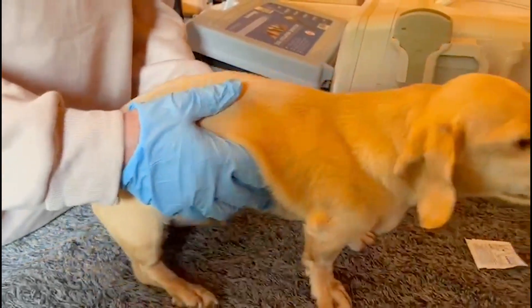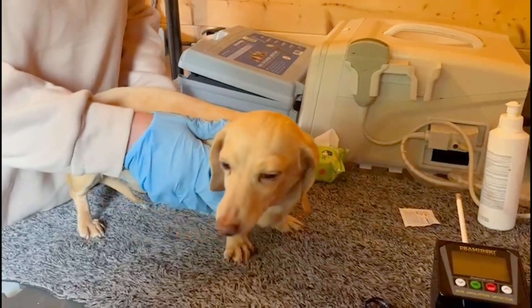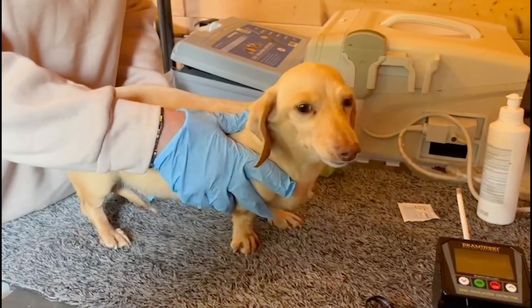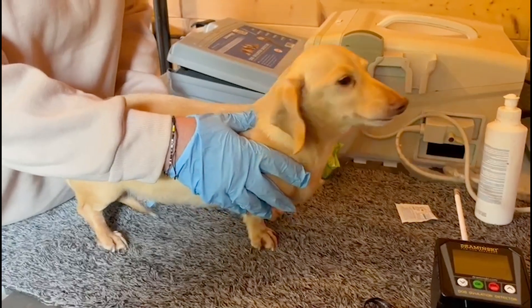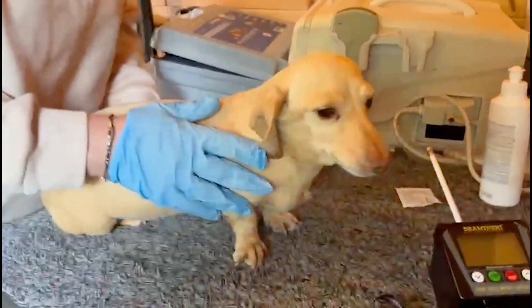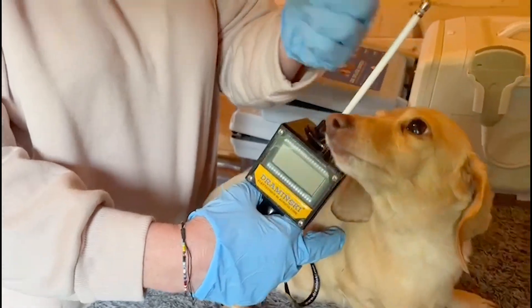Thanks to the Draminsky Ovulation Detector, we are very successful in all our litters and our stud jobs. We use them for everyone that comes to use our studs, and we've got 99.9% success with it.